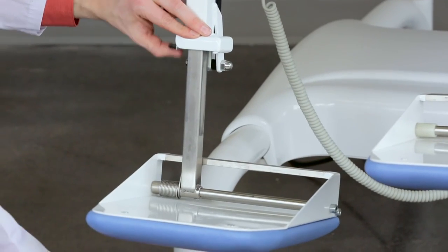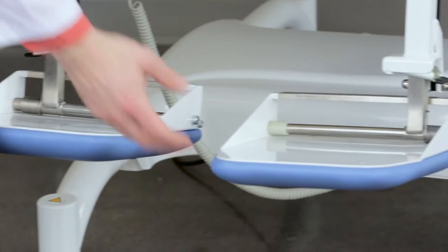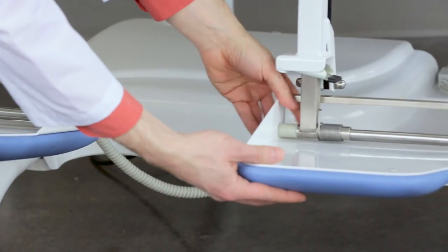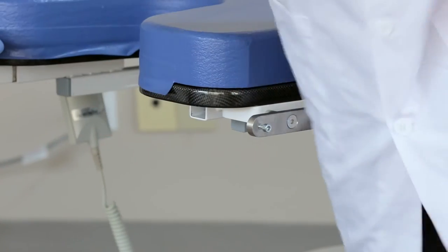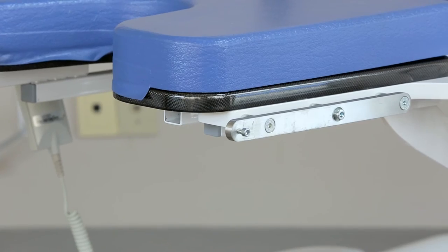The length of the footrests can be adjusted by lifting the black latch on the side. The footrest can be slid left or right to suit the patient. To remove the footrests, lift the silver triangle piece above the black lever and slide the footrest out.